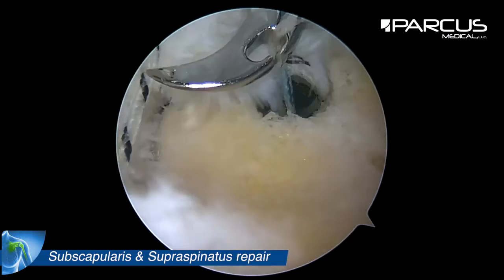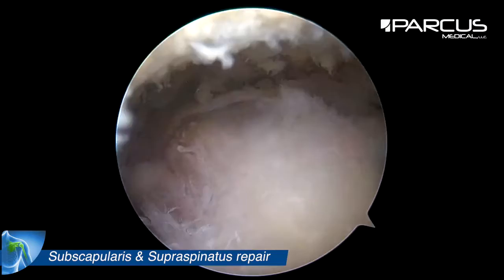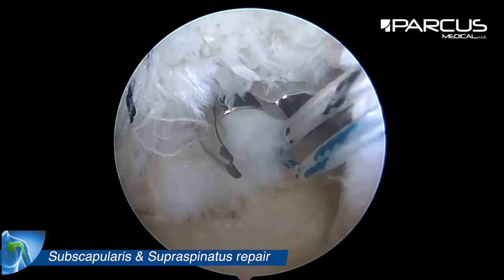Next step is to grab the tape through the supraspinatus — one strand of each suture at the anterior part of the tendon and the two other ones at the posterior part of the tendon.